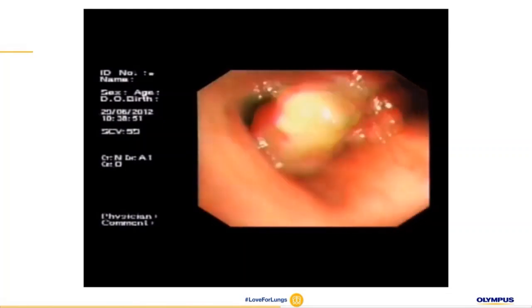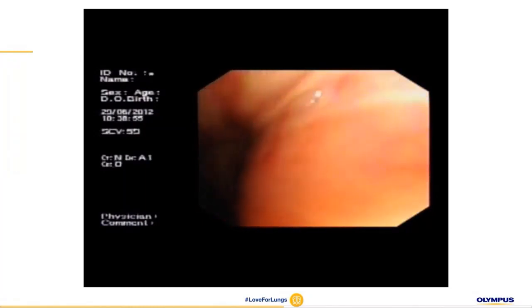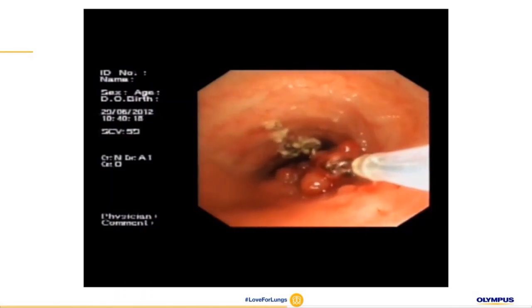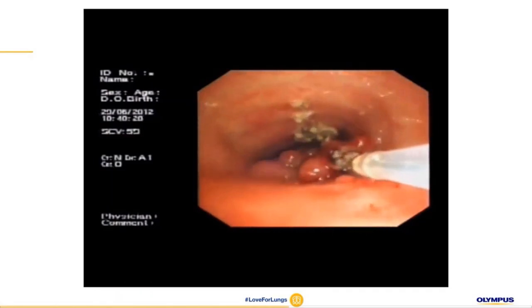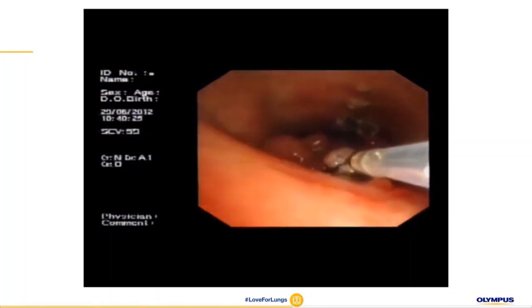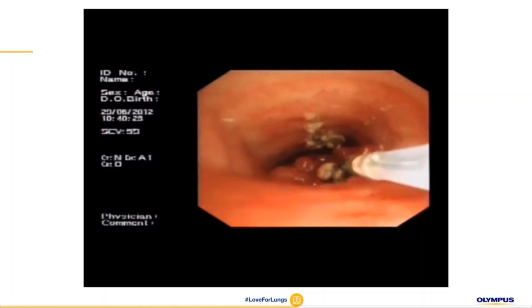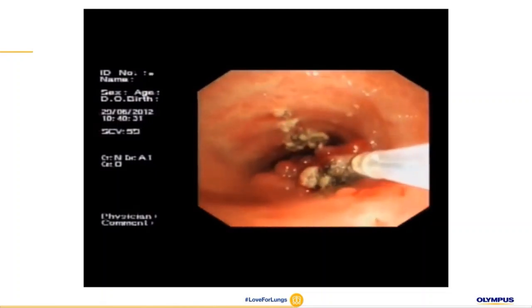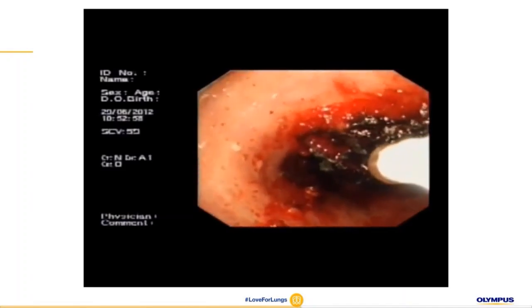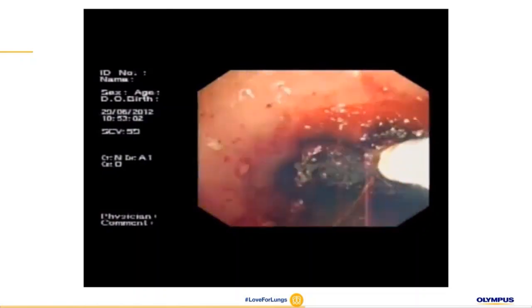And how would we have approached this in the past? It would have been to use laser ablation, as we did for this case, or sometimes mechanical debulking. Whilst laser works really well in this case, as you can see, it coagulates and ablates the tumor as we go along. We all know that when we're looking at carcinoid in the airway, bleeding is a problem. You can see everything starts to become a bit red, there's a lot of bleeding.